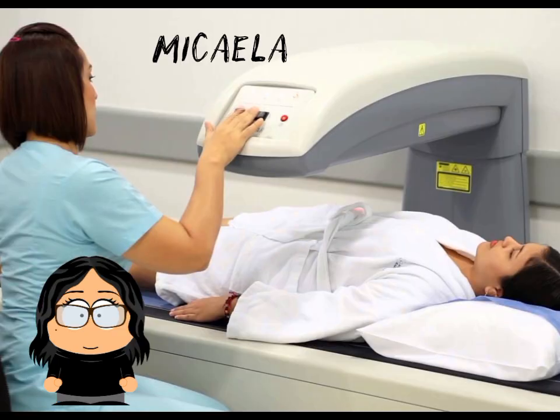Bone densitometry, also known as DEXA or DXA, is a test that uses low-dose X-rays to measure bone mineral density. It helps evaluate the effectiveness of treatment for osteoporosis and other diseases that cause bone loss. How is it performed? The test requires no special preparation, is painless, and has no side effects.